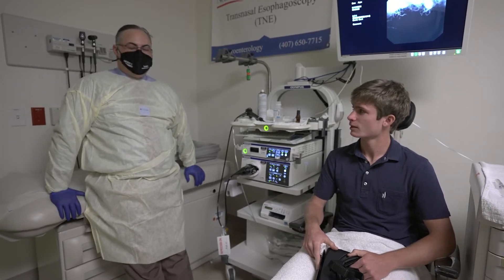One of the benefits of the TNE procedure is that we are very much focused on quality of life — having children and families thrive and be at their level best. This will alleviate the need for anesthesia for some patients and really take that component out of their care plan.